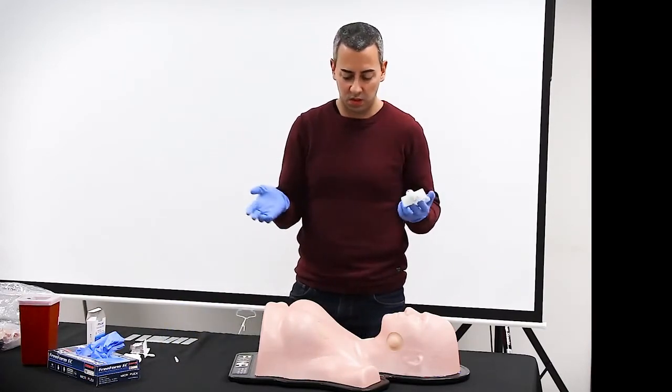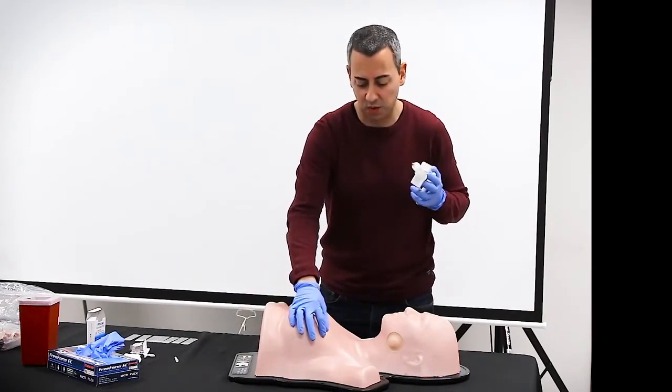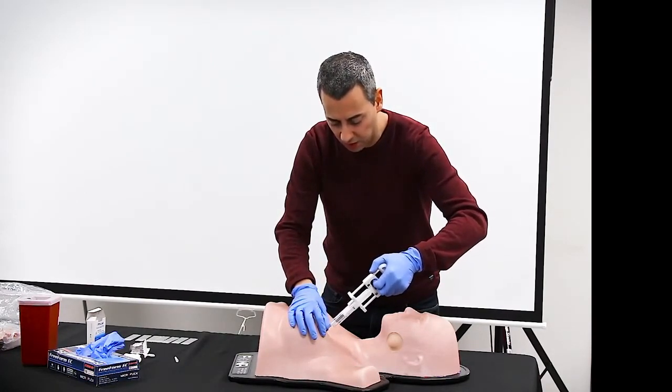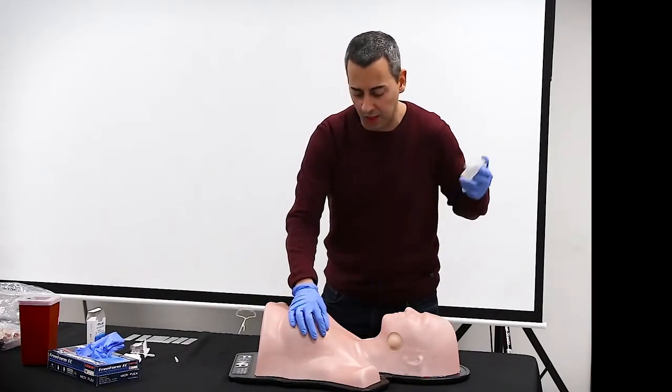So with one hand you have to fix the lesion, and with the other hand you perform the procedure. You insert the needle, you create vacuum, and then you release, and then you extract the needle.